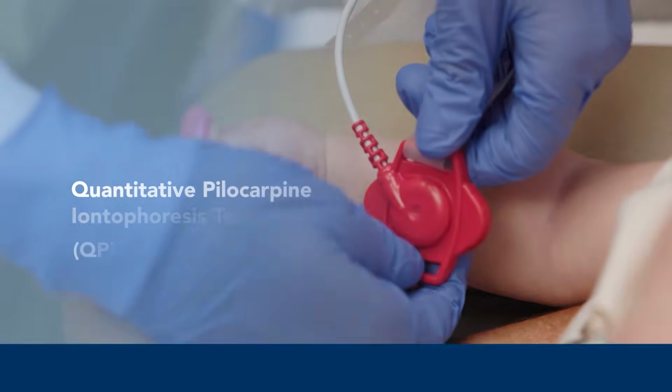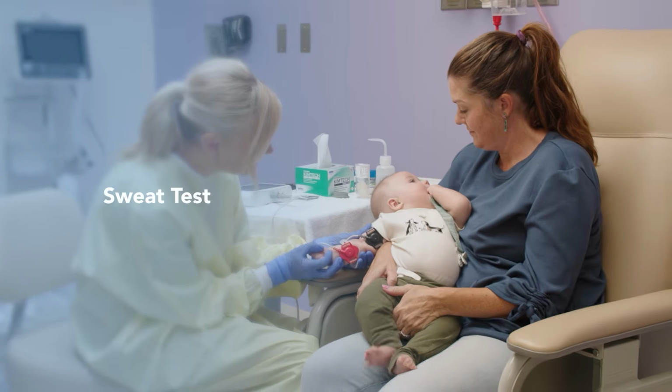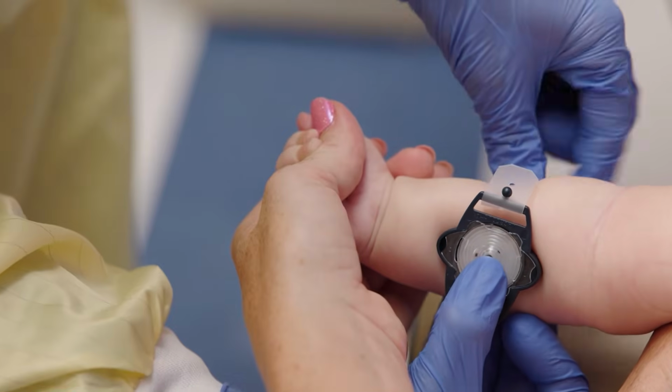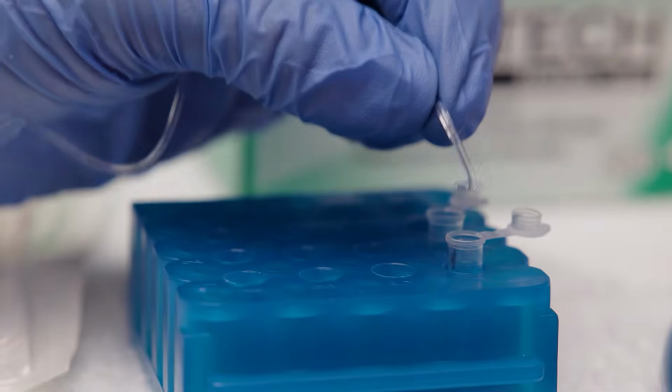Most people with CF will have chloride concentrations greater than or equal to 60 millimoles per liter. Sweat chloride concentrations between 30 to 59 millimoles per liter are considered intermediate and require further evaluation. The quantitative pilocarpine iontophoresis test, or sweat test, is considered the gold standard for diagnosing CF. Performing the sweat test accurately is critical to making a timely diagnosis.